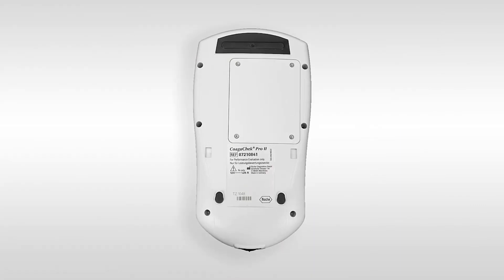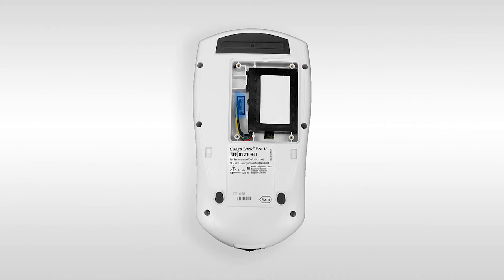You can use the barcode scanner to identify both patient and operator IDs and also the quality control solution. To insert the battery, use the supplied screwdriver to remove the battery cover. Firmly insert the connector plug of the battery into the socket, then place the battery into the compartment with the cables pointing down and reattach the battery cover.